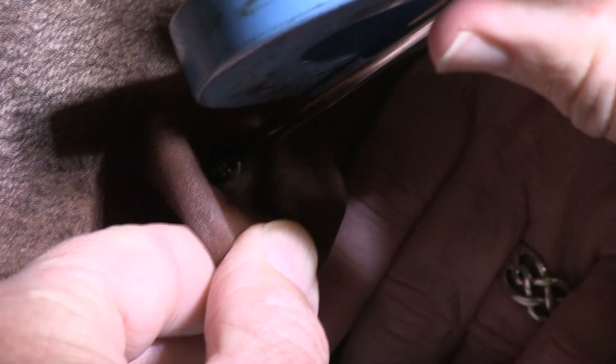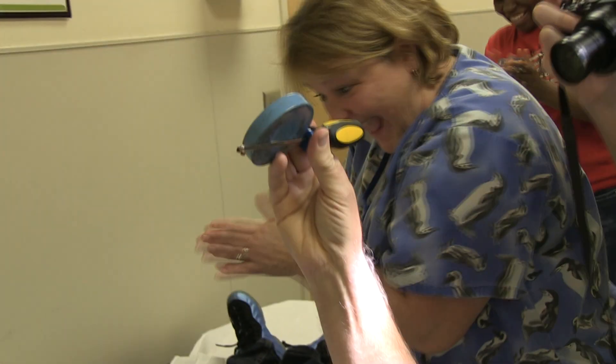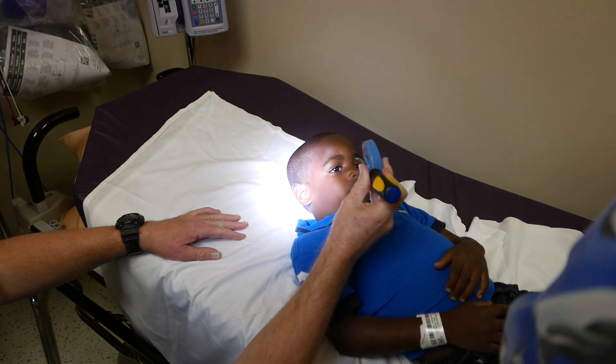Do you have a brother or a sister? Wasn't that a piece of cake? See, that's the screw that was in your ear from the dinosaur.